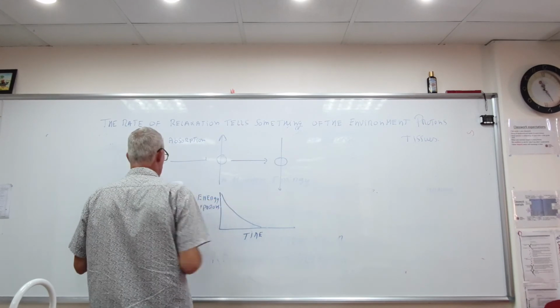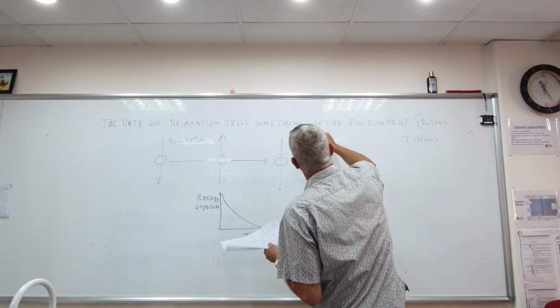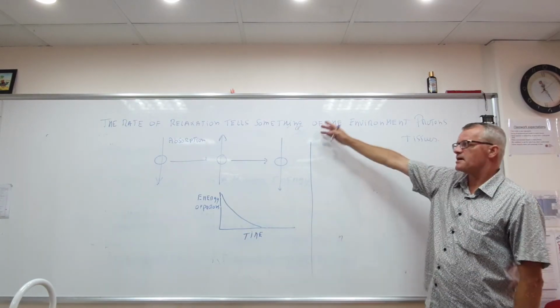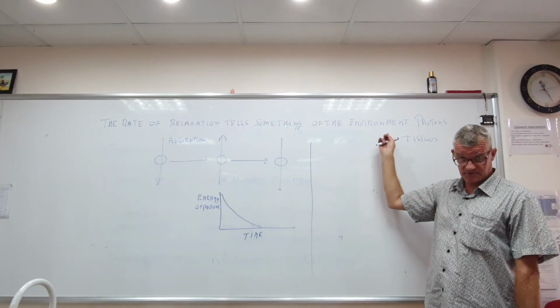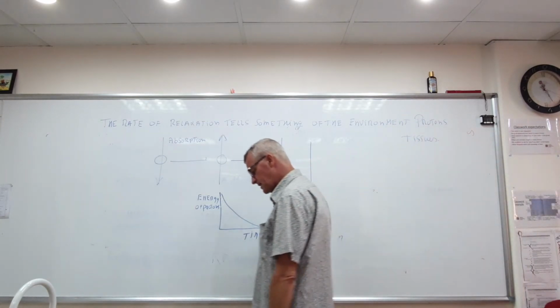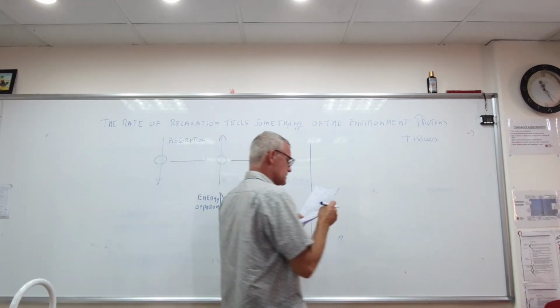Energy of protons. Okay? And now the interesting part is, how do we see the different tissues? And this actually is related to the relaxation time of the protons, yeah, in different tissues. Each tissue, the relaxation time is different. Okay?